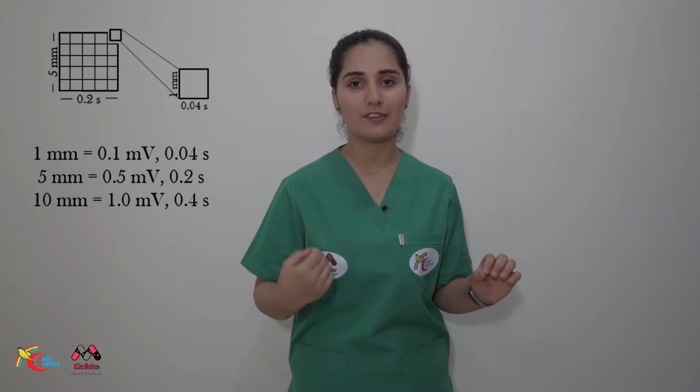Now, the horizontal axis is also divided into small and larger squares. Each small square represents 0.04 seconds, and the large square, which is composed of 5 small squares, represents 0.2 seconds. Now, for the amplitude, each small square is equal to 0.1 millivolt or 1 millimeter.